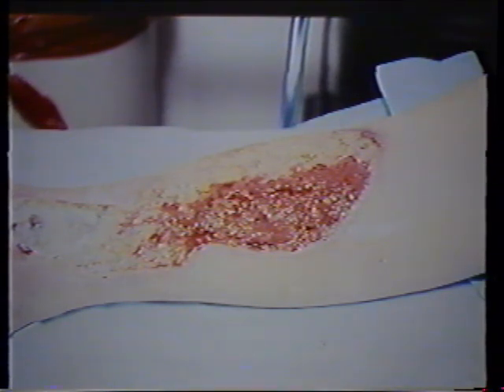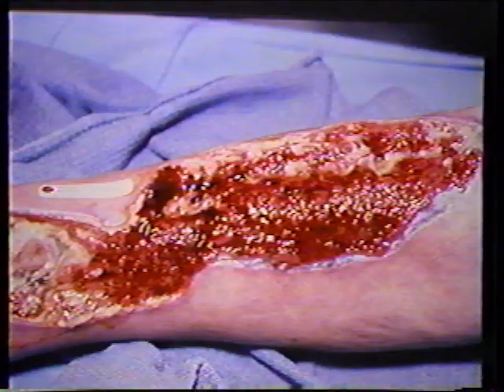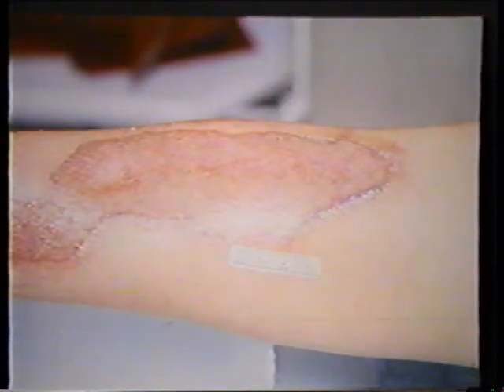This is a very typical indication for the hyperbaric chamber: an older diabetic patient who just had coronary artery bypass surgery. Veins were harvested from the leg, and the harvest sites failed to heal. Despite excellent wound care, every time the vein harvest site was debrided the wounds got bigger. He was contemplating suicide because he did not want to lose his legs — it was a bilateral condition. He was eventually shipped here and started in the chamber. After hyperbarics, a richer color appeared, exuberant granulation tissue started, and we got a base for grafts. The graft was applied, and finally grafting was complete — he saved both lower limbs.